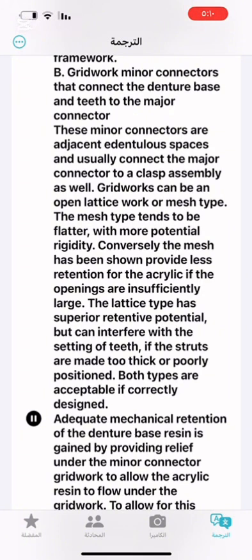2. Transfers the effects of the retainers, rests, and stabilizing components throughout the prosthesis. This is an abutment to prosthesis function of the minor connector. Thus, forces applied on one portion of the denture may be resisted by other components placed elsewhere in the arch for that purpose. A stabilizing component on one side of the arch may be placed to resist horizontal forces that originate on the opposite side. This is possible only because of the transferring effect of the minor connector, which supports that stabilizing component, and the rigidity of the major connector.